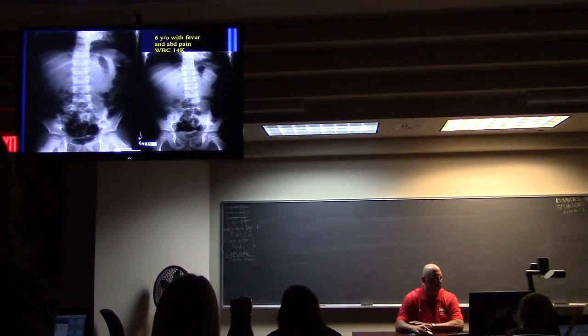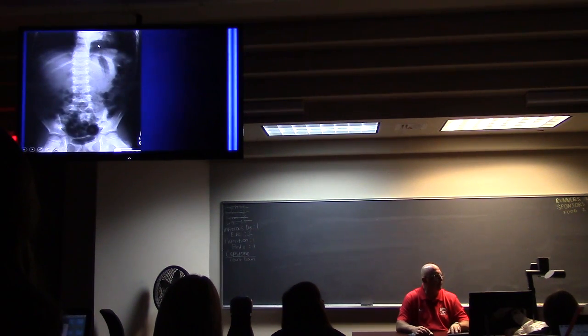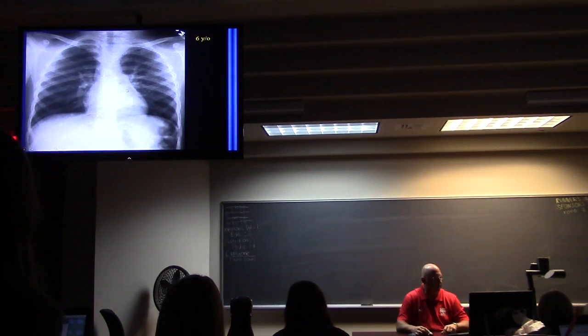So here's the thing, they didn't do a chest x-ray, which really should be a part of an abdominal series. They didn't do a chest, but look up here. You can kind of see the chest. What the heck is all that? I would be suspicious that he's got pneumonia. But now comes the chest x-ray. Do you see a pneumonia? Not really, but yeah, you do. Look behind the heart here. That's just like a big old mass behind the heart. I hope the next one's a lateral. Please God, let this next one be a lateral. Nope. Oh, this is another repeat. We're looking at the abdominal films again. It still looks like an infiltrate, retrocardiac. I guess it just didn't get the lateral, but there is an infiltrate.